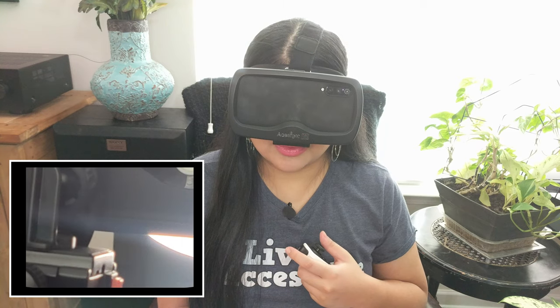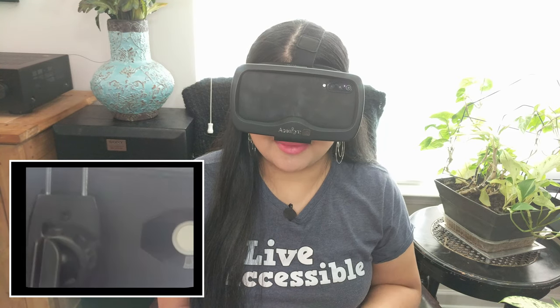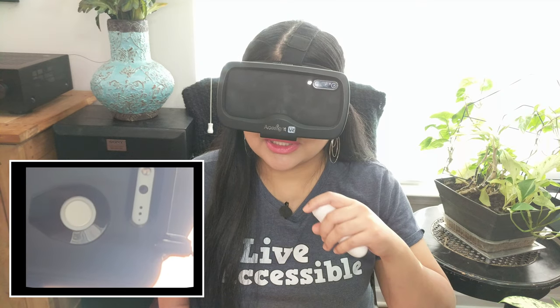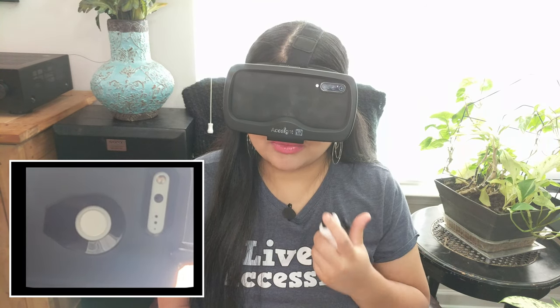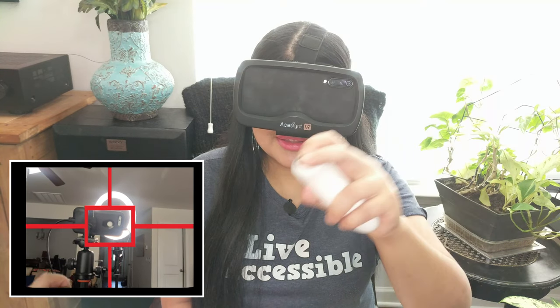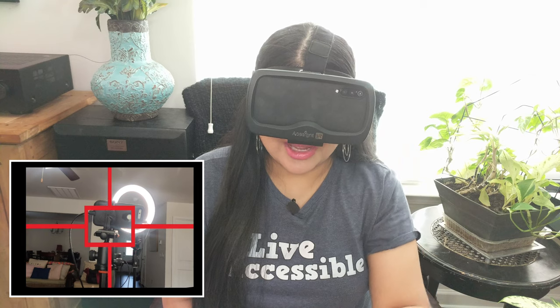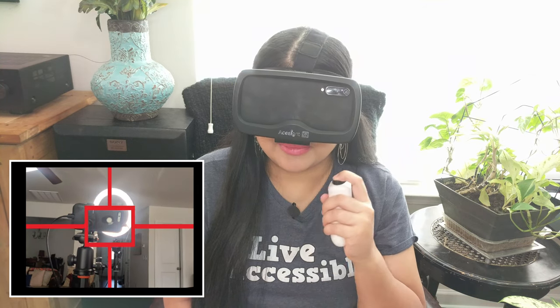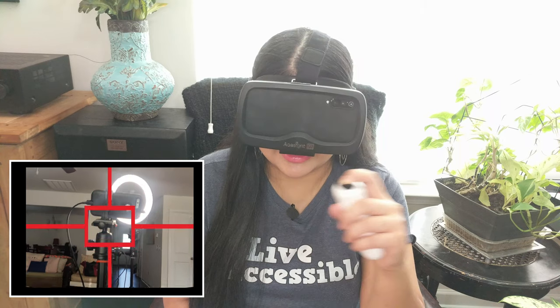This also works when you're looking at something in your environment. So for right now, I'm looking at the phone, but I want to see what's around the phone. So I just press and hold that. And now I can see the light, and I can see the tripod next to it, and I can see where the phone is, and that way I can get a better idea of everything around it.